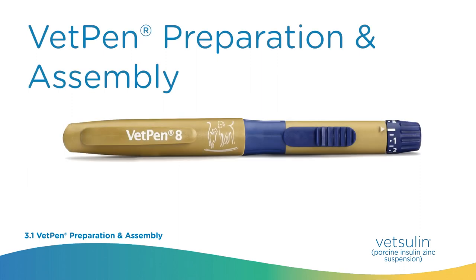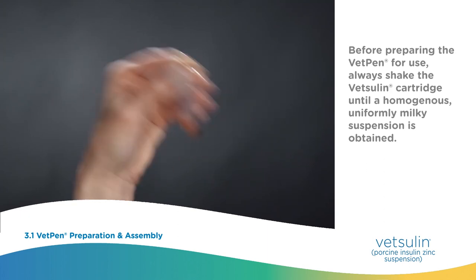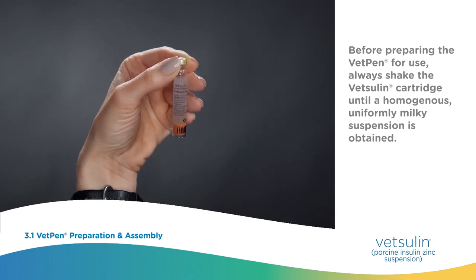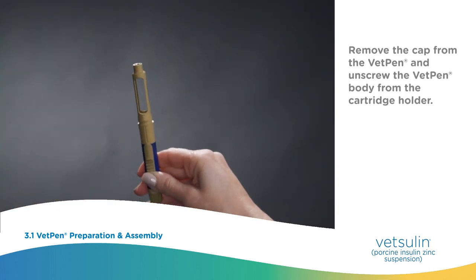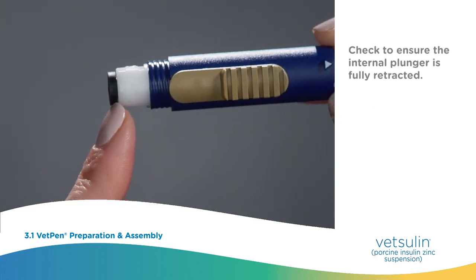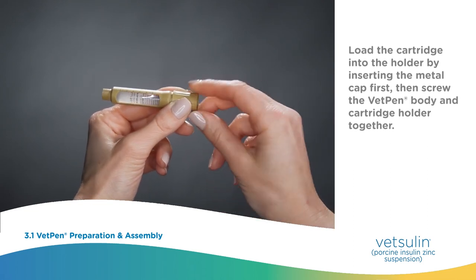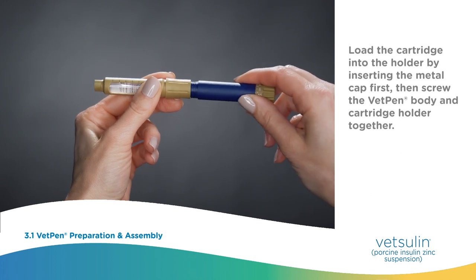VetPen preparation and assembly. Before preparing the VetPen for use, always shake the Vetsulin cartridge until a homogenous uniformly milky suspension is obtained. Remove the cap from the VetPen and unscrew the VetPen body from the cartridge holder. Check to ensure the internal plunger is fully retracted. Load the cartridge into the holder by inserting the metal cap first, then screw the VetPen body and cartridge holder together.